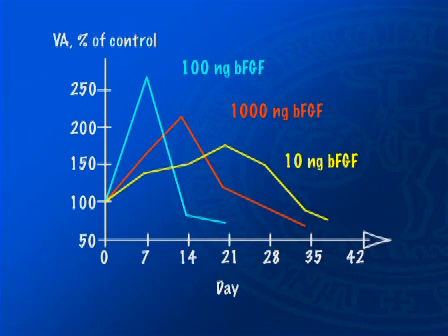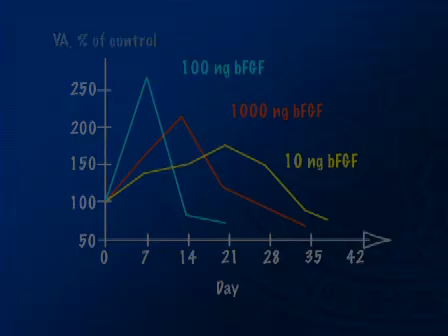Studies of this kind have revealed that the de novo angiogenic response to any growth factor or cytokine tested is specifically dose-dependent in terms of velocity, potency, and duration. Moreover, the pattern of the new vessels in terms of the spatial extension and changes in the microvessel density is often distinctly dose and time dependent.